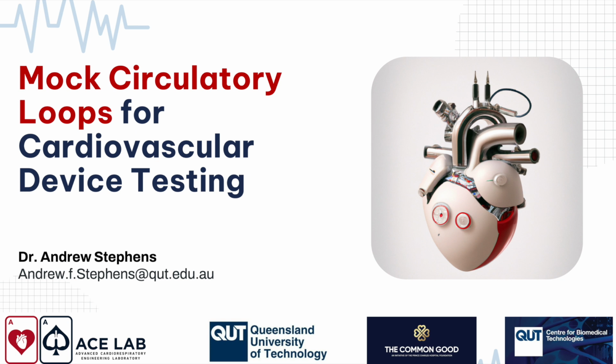The step between CFD and mock loops is PIV. If you design a PIV rig that's driven by a mock loop, you can get very strong, hemodynamically relevant ideas about what your blood flow is going to look like in your pump, based on your modeling.